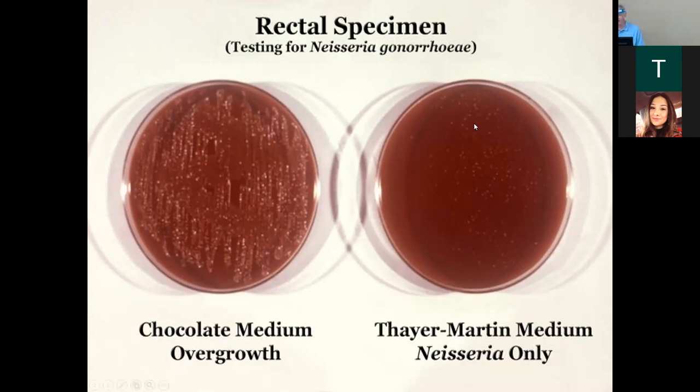Thayer-Martin, definitely. We'd say, oh look, if we had this, we're not doing anything with that. That's way too many different things over here. But if we had Thayer-Martin, we don't miss it. We'd miss it over here if we're just doing chocolate only. We're not setting this up, we're setting this up.